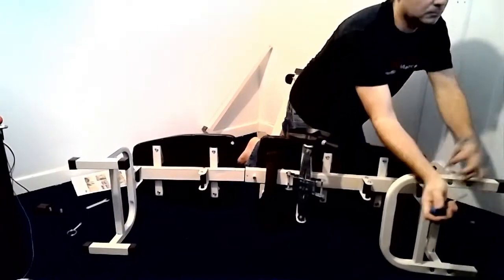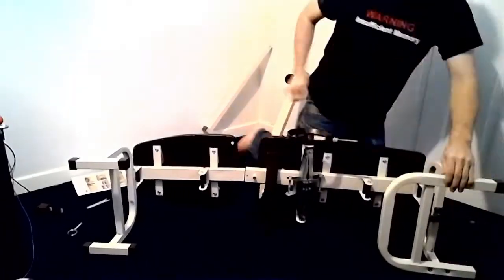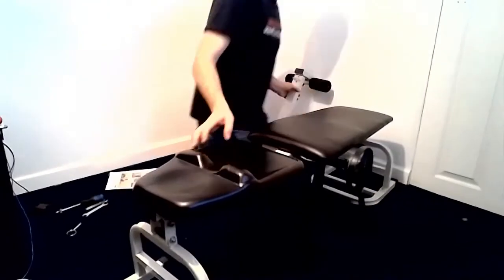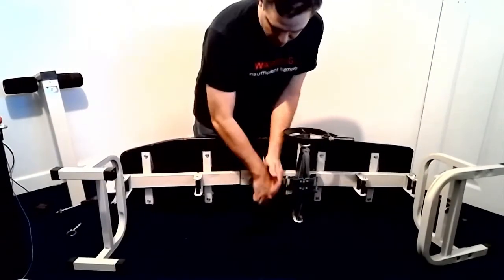If you did not tighten down the Phillips screws on leg frame pieces A and B at the beginning of the video, do so now. If you left a gap between the two frame pieces earlier in the video, please remove that gap now.